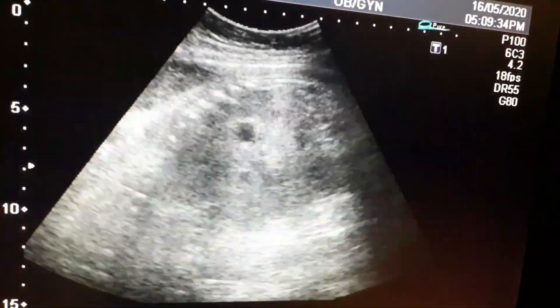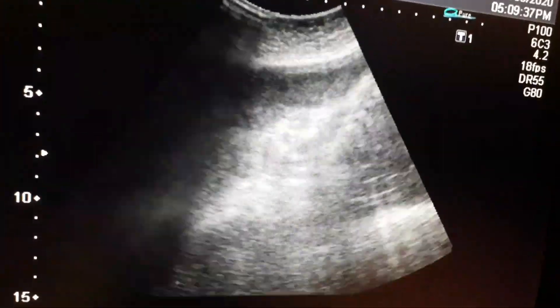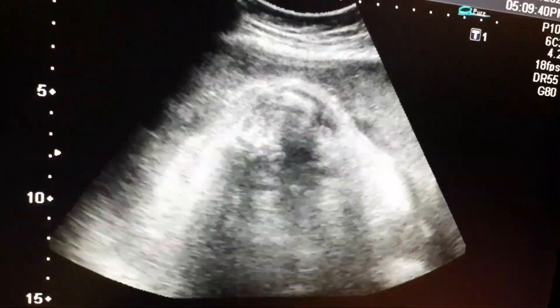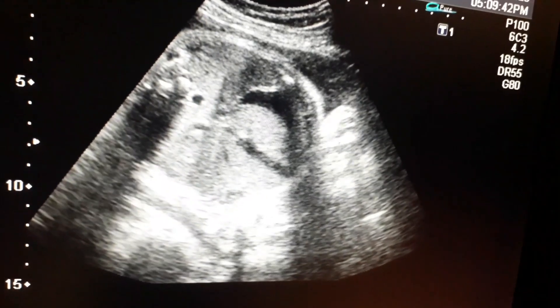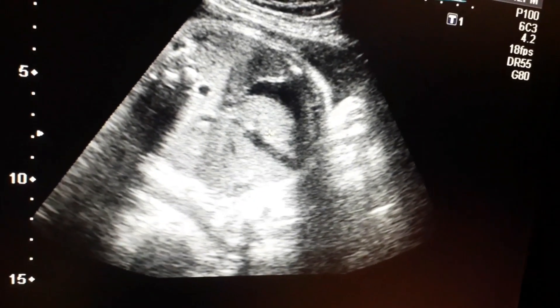You can appreciate the spine of the fetus as well. Now I am going to calculate the abdominal circumference at the level of the gastric bubble. It is about 36 weeks.